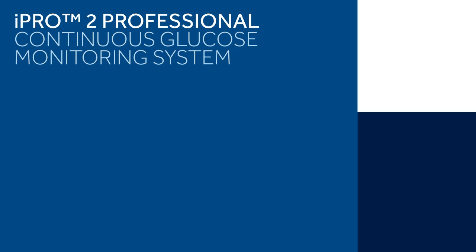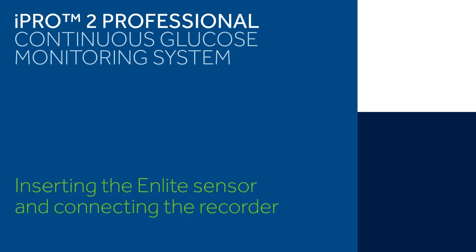iPro2 Professional Continuous Glucose Monitoring System: Inserting the Enlite Sensor and Connecting the Recorder.